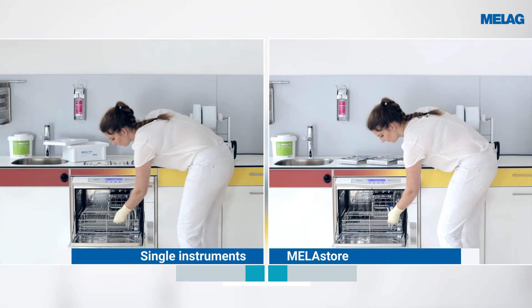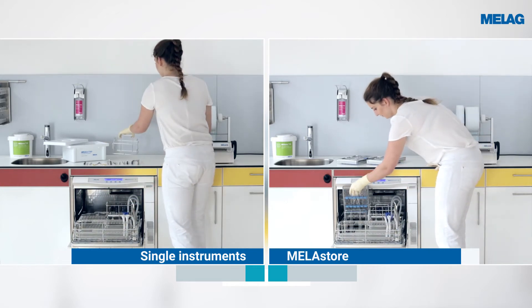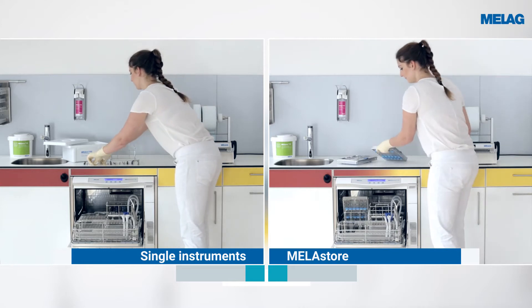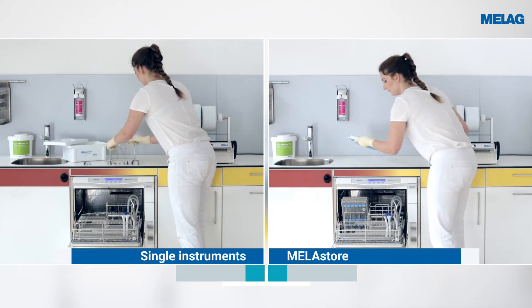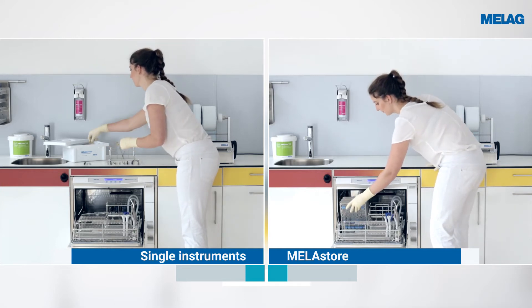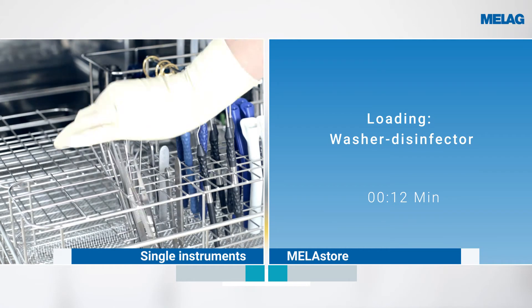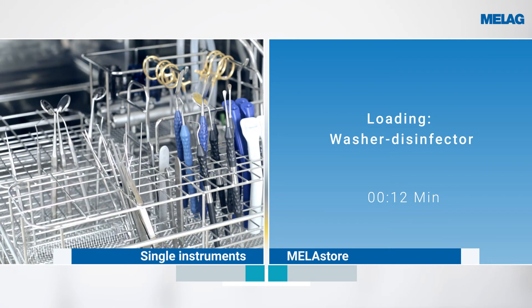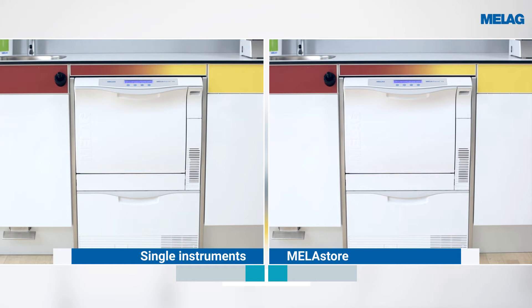The loading of the washer disinfector with 36 individual instruments on the left-hand side of the picture is ergonomic and simple. The use of the Miele Store trays on the right-hand side of the picture not only reduces the danger of injury, but saves over two minutes per decontamination procedure when treating the same number of instruments.